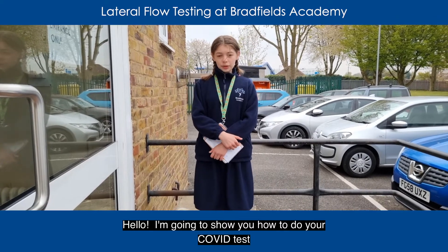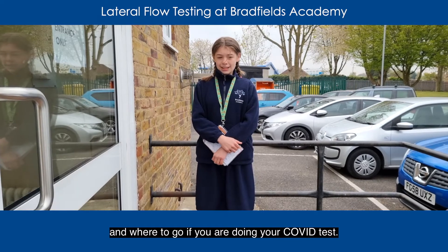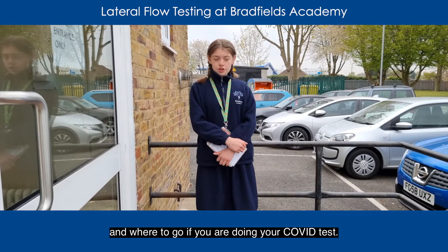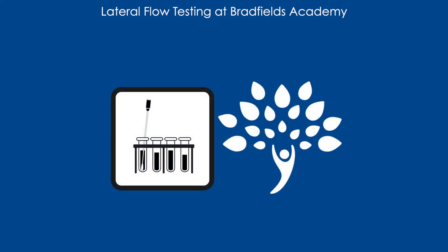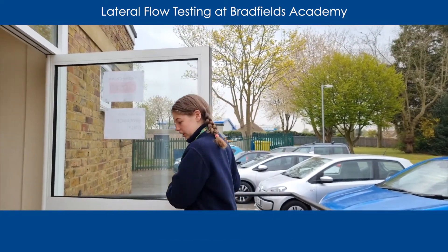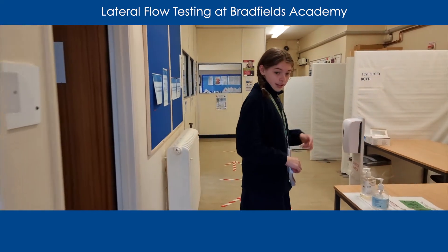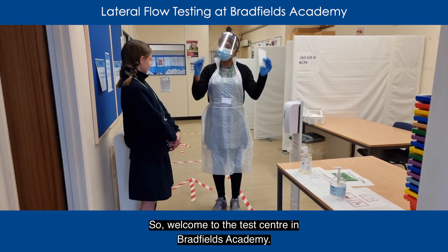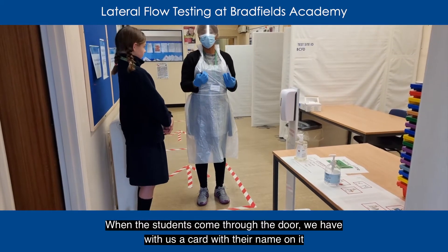Hello, I'm going to show you how to do your COVID test and where to go if you're doing your COVID test. So you go through this door and then you come in here. Welcome to the Test Centre in Bradfields Academy. When the students come through the door, we have with us a card with their name on it so the students are already stood.